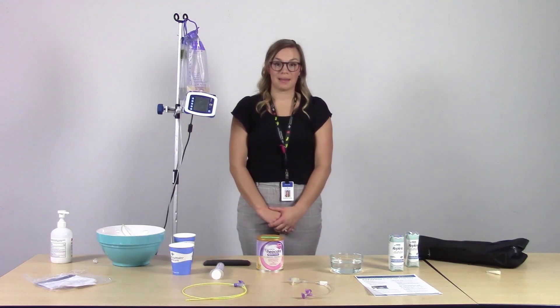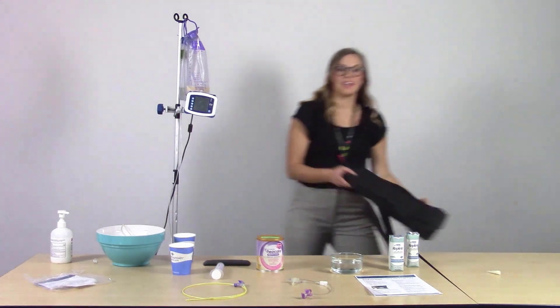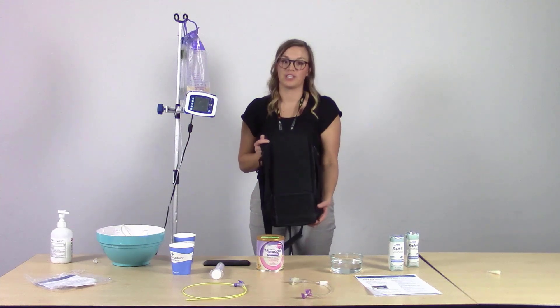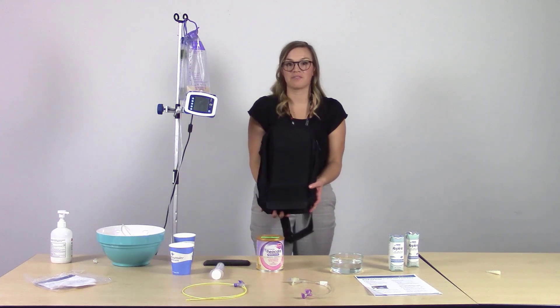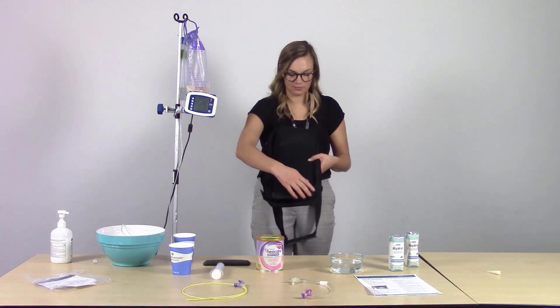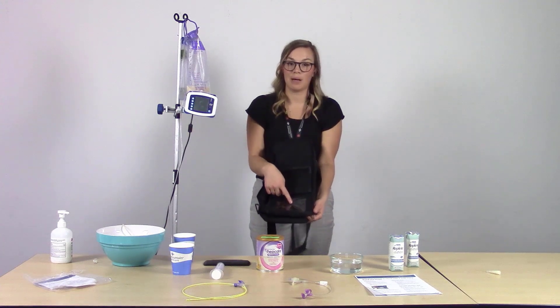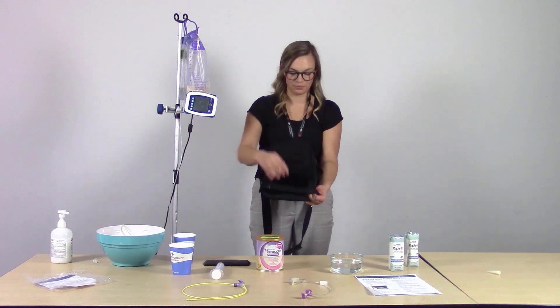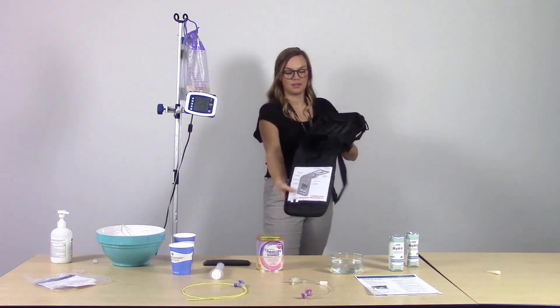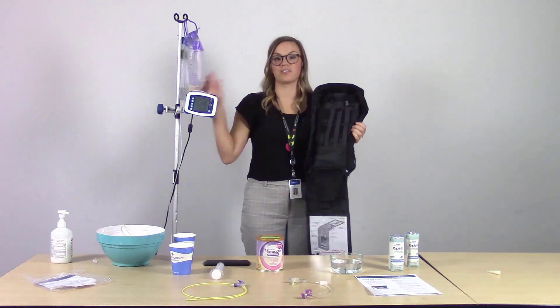Next, we're going to talk about using a backpack with the Kangaroo Joey Feed and Flush Bag option. Intermountain Home Care and Hospice will provide a backpack so you can be on the go while still doing your enteral or tube feeding. It has a front pocket with a clear plastic window to see the pump settings, a main unzippable pocket, a pouch where the pump sits, and a back area where you set the bags.